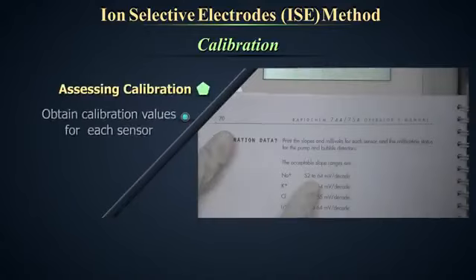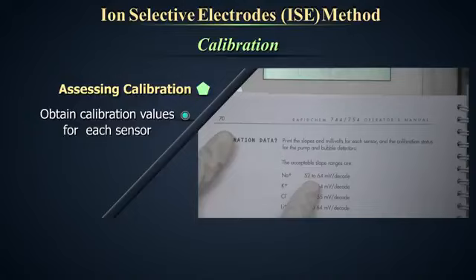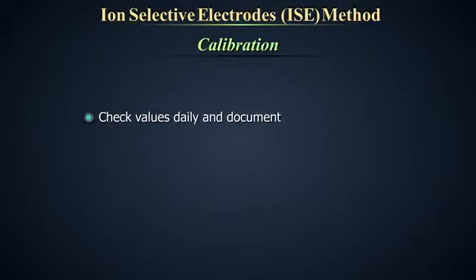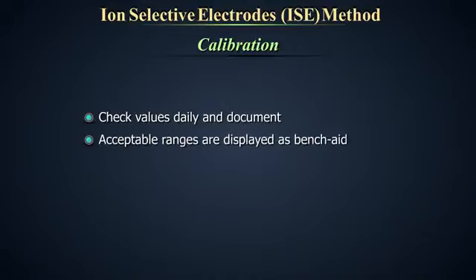Assessing calibration. The calibration performed by the machine is assessed by obtaining calibration values for each sensor. These values should be within acceptable ranges, which are defined by the manufacturer. Check these values daily and document. Acceptable ranges should be displayed as a bench aid near the equipment to give ready reference to its performance.